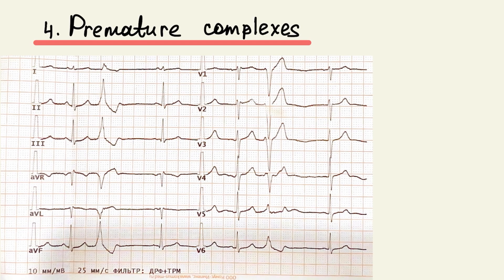Premature complexes. Single atrial or ventricular premature complexes are normal for every person. On this ECG, we can see a ventricular premature complex — broad and abnormal with discordant ST segment and T wave changes, usually followed by a fully compensatory pause.